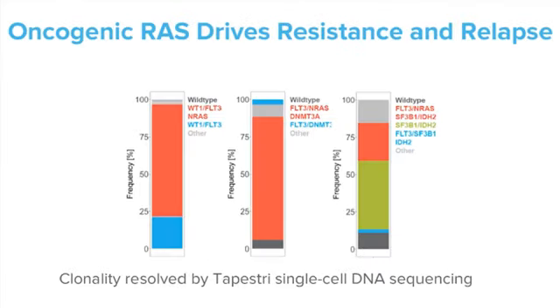And this is shown in these three bar plots, each of which represents an individual patient. In each of these patients, the size of the red bar represents the size of the relapse co-mutated FLT3 and NRAS mutant clone. You can see that in each of the three patients, there were also other mutations that occurred in this relapse clone. On the left, this patient had a triple mutant WT1 FLT3 NRAS clone that made up the bulk of the relapse, with a smaller proportion of the blue clone, which was the ancestral WT1 FLT3 mutant only clone that was presumably still sensitive to FLT3 inhibitor.